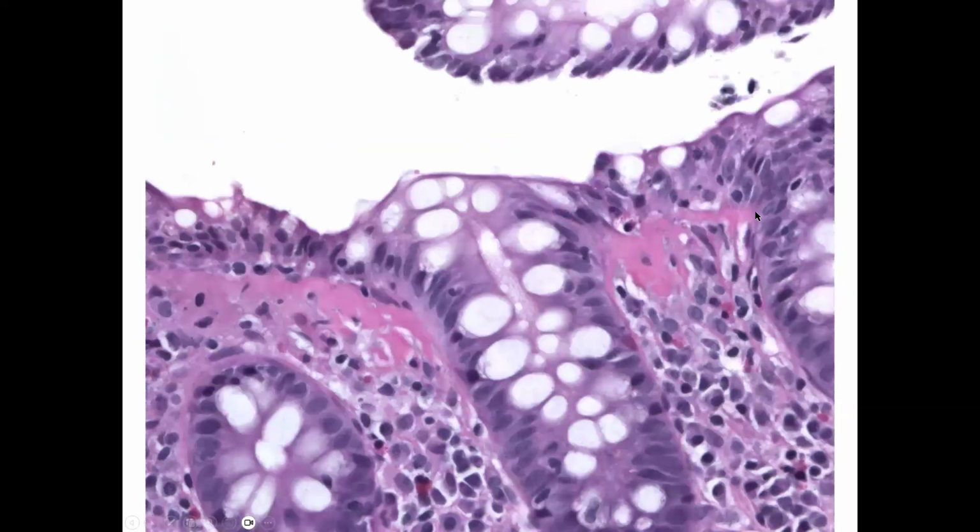When we look around a little more, we can see that the basement membrane, which sits underneath the epithelium and helps to anchor it, is expanded, and it reaches down and crawls into the lamina propria superficially. Here you can see why pathologists sometimes call this dripping wax. It really resembles dripping wax, crawling down in these little tentacles, reaching into the lamina propria, even entrapping cells from the lamina propria. So this is an abnormal pattern for the basement membrane.